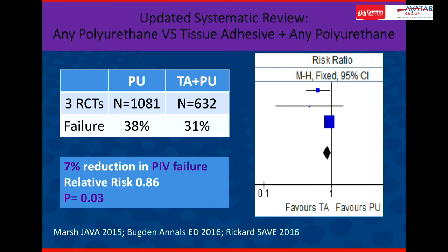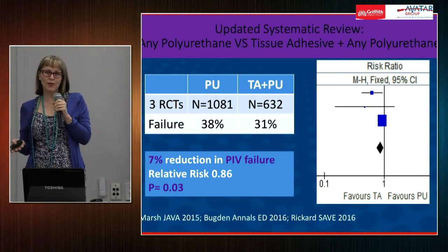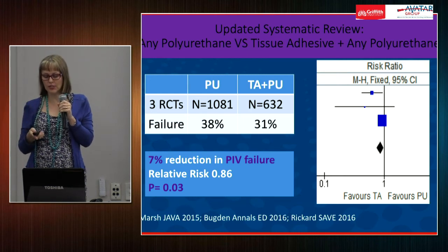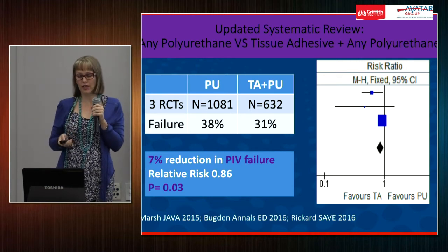But the problem, of course, with glue is it's very fiddly. You need someone who knows what they're doing to put it on, because you only need a very small amount. So you can't really just put it on the IV trolley and let all the RMOs and everybody have it, or you're going to have people stuck to the patients. And that's not a joke, we have done that ourselves. It's also expensive at the moment, and there's too much in the applicators in Australia. Now the manufacturers are working on that. Again, we'll soon be seeing small applicators, lower price coming through. So it is coming.